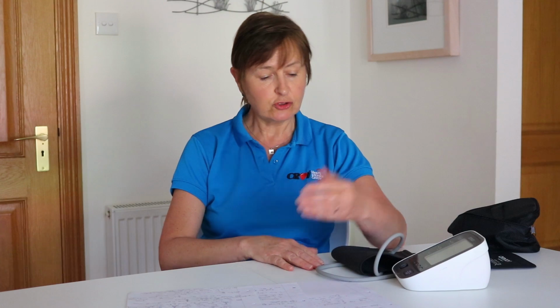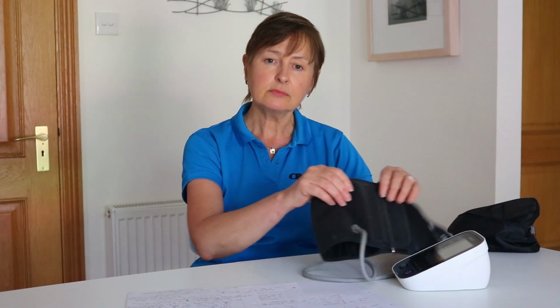Before you start, you need to not smoke. Don't drink any caffeinated drinks, so tea or coffee, or exercise for at least half an hour beforehand. Then you need to get yourself comfortable. Sit well into the chair with your back supported and your 2 feet flat on the ground. Make sure you have a table or a desk so that you can rest your arm.